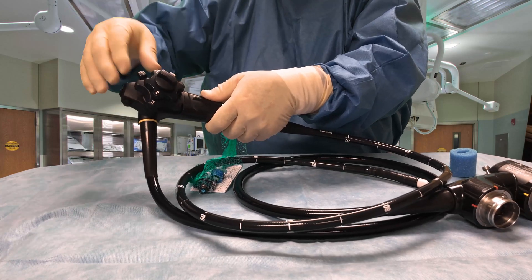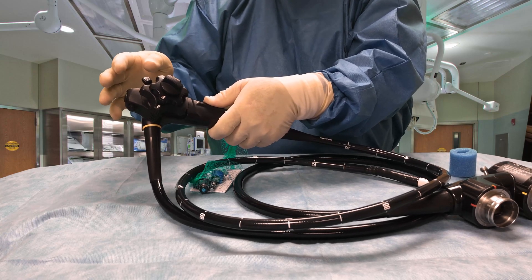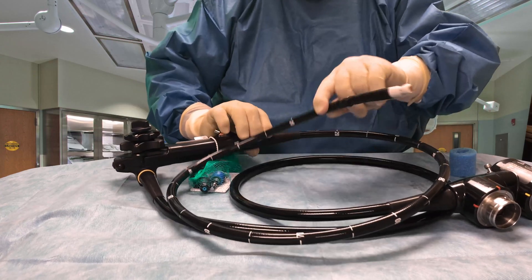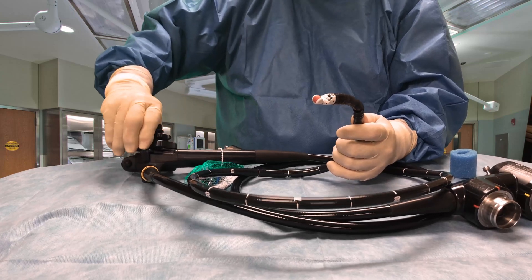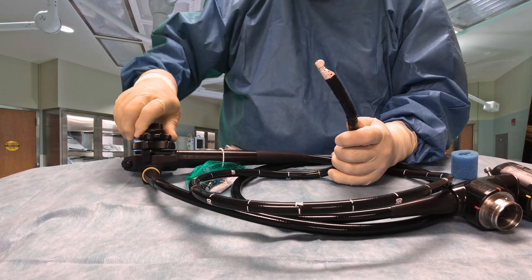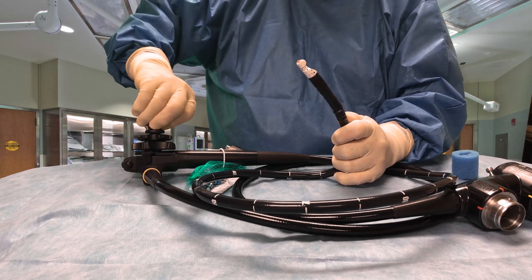We want those in the free position when the scope is being cleaned and when it's drying. The only time it goes into a lock position is if the physician happens to bend or angle the tip in a certain direction — either left, right, up, or down — and wants to keep it in that position. He will hit the lock button and that will make it stay where he wants it.